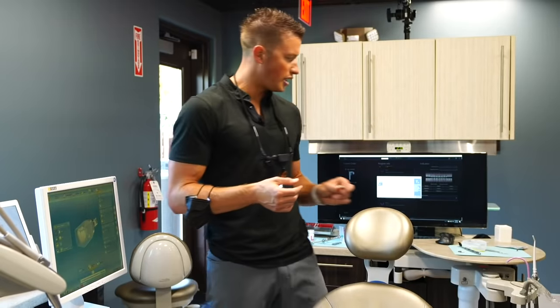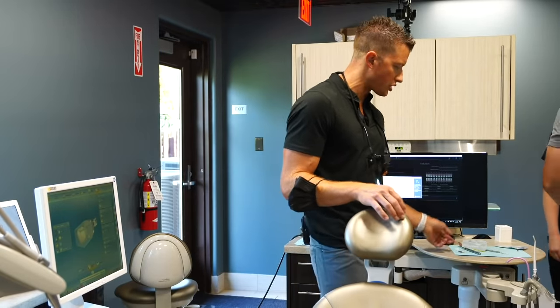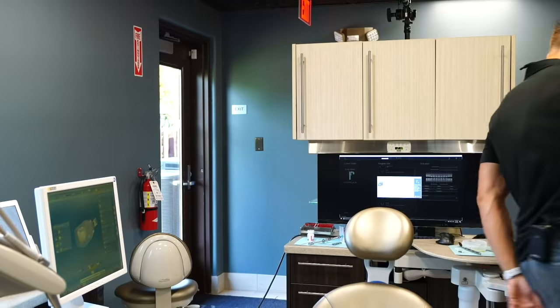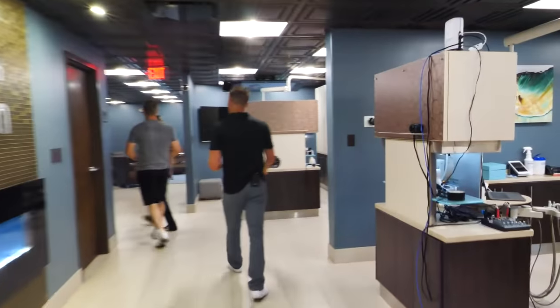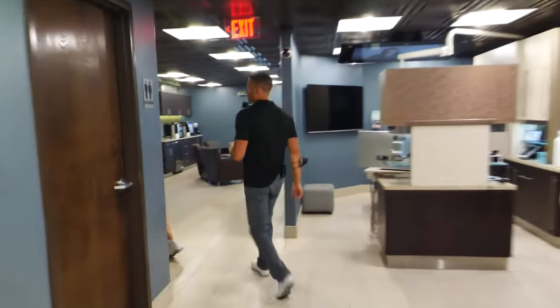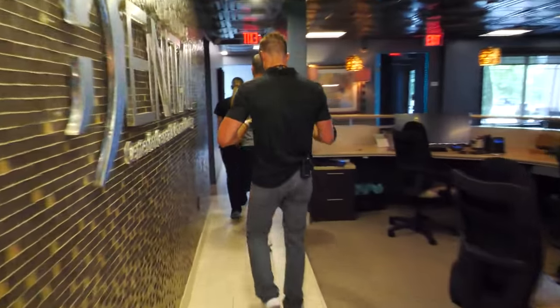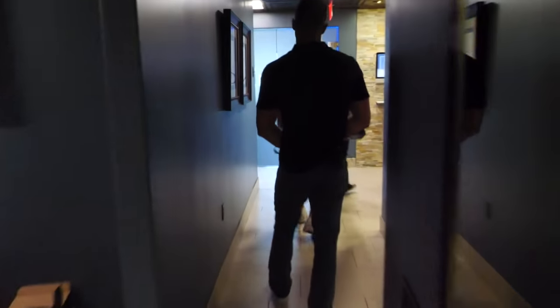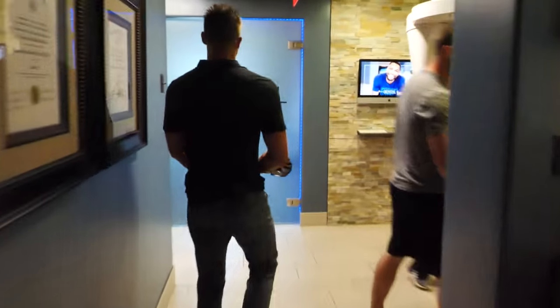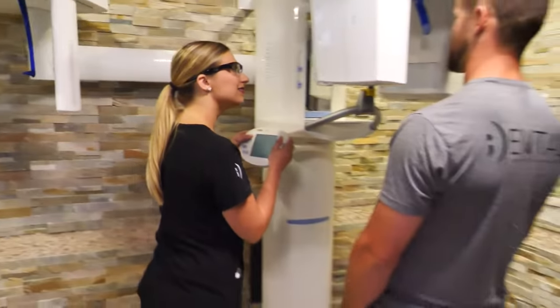All right, time to follow Trey. We've got this 3D imaging machine that we're going to use to take an impression. You guys just walk, I'll talk about it. If you're familiar with a medical CT, it takes about 100 slices, I believe, and they can change that depending on what they're trying to image. A doctor might order a CT scan, and it passes around the body many times in increments to create a three-dimensional model of the bone and tissue.